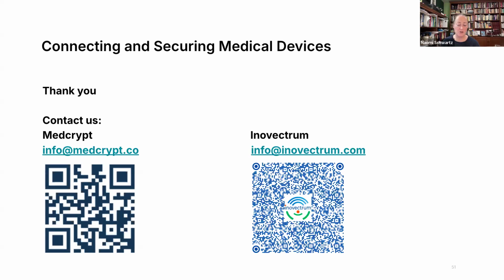When you work with a penetration test house, you may work with one that will go to the extreme of cracking the case. In some cases, I know that some CGM manufacturers had theirs tested and somebody actually unpotted the epoxy, which takes some knowledge of chemistry, some lab equipment and a really good ventilation hood, because that stuff stinks and it's probably not good to breathe in. But they unpotted these things in a way that they could confirm they did not damage the printed circuit boards. Do you have to go that far?